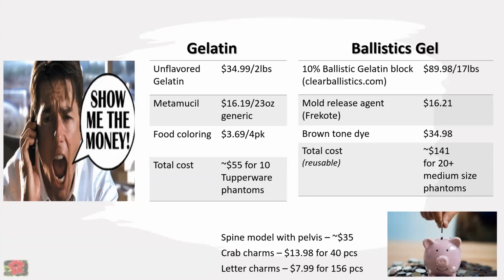For the big block that I have, so far I have made almost 20 task trainers, medium sized, for umbilical lines and vascular access, the bladder and the spinal tap. And if I run out, I still have some left from the block. I didn't completely finish the block, but I can remelt it again. But you cut them into small pieces and then take whatever is needed for how many you are making instead of melting everything. Yes, is that right?